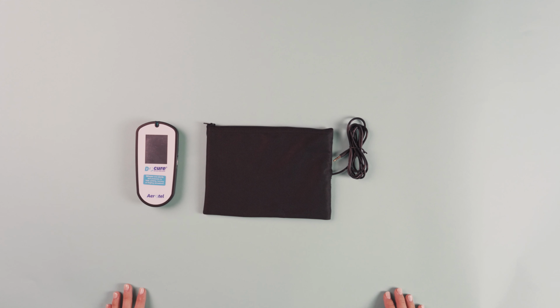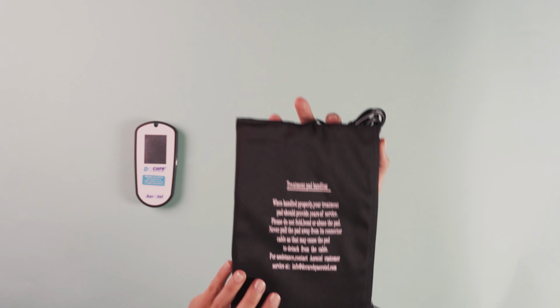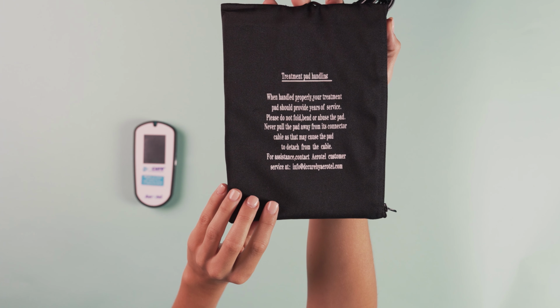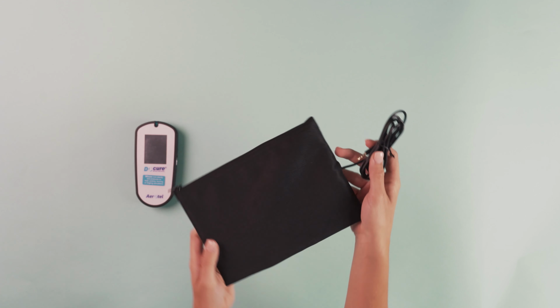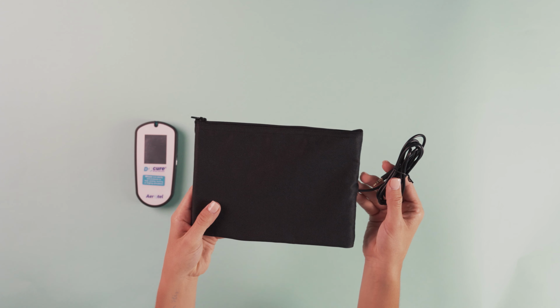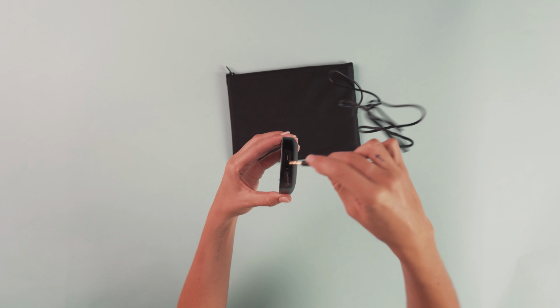DC Cure delivers its therapy via its unique treatment pad. When handled properly, the pad should provide years of service. The pad can be placed either side up. It can be positioned over light clothing since direct skin contact is not required, but it should not be folded or bent. You should never pull the pad away from its connector cable, as that may cause the pad to detach from the cable. When connecting the pad to the unit, you must insert the cable plug fully into the unit's cable plug socket located on the bottom of the unit.